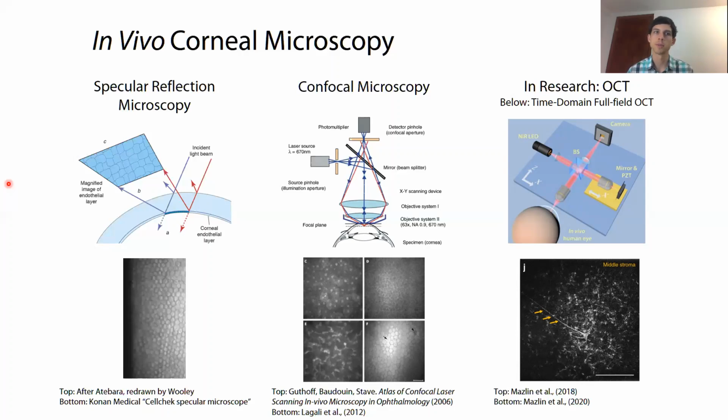Alternatively, transmission mode imaging would avoid some of the stray reflection issues. For instance, if we were to reflect some light off of a posterior structure, such as the fundus, we should be able to transilluminate, or as we say, retroilluminate the cornea.